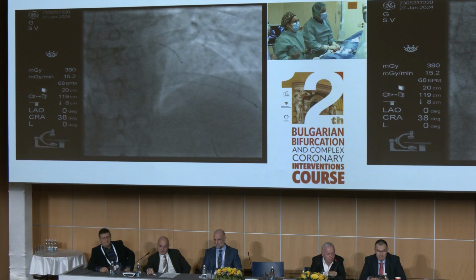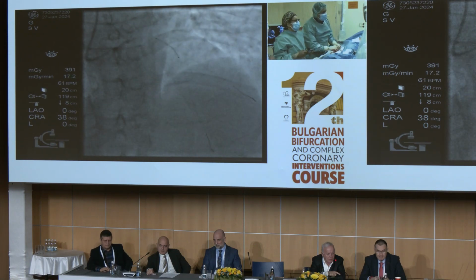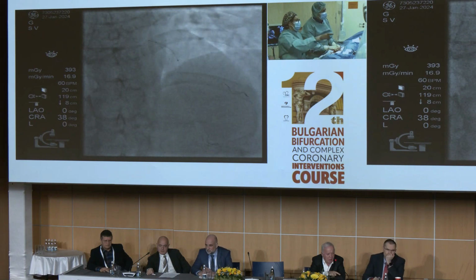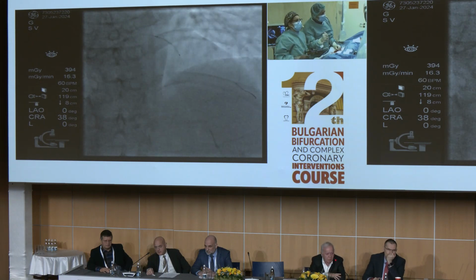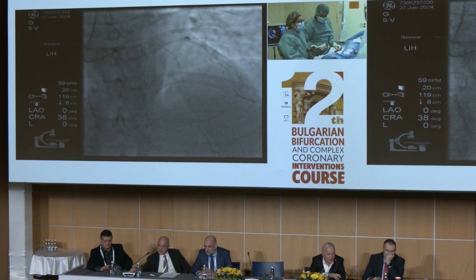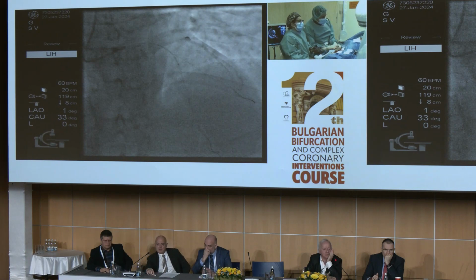Let's check. Maybe we have to readjust a little bit more distal in order to be sure that we are not stenting the circumflex. A small test. At 45, it is a little bit clearer, the origin of the circumflex. We can also change the projection. A bit more distal, take more care. Let's change the projection to caudal. Caudal, yeah, that's fine.